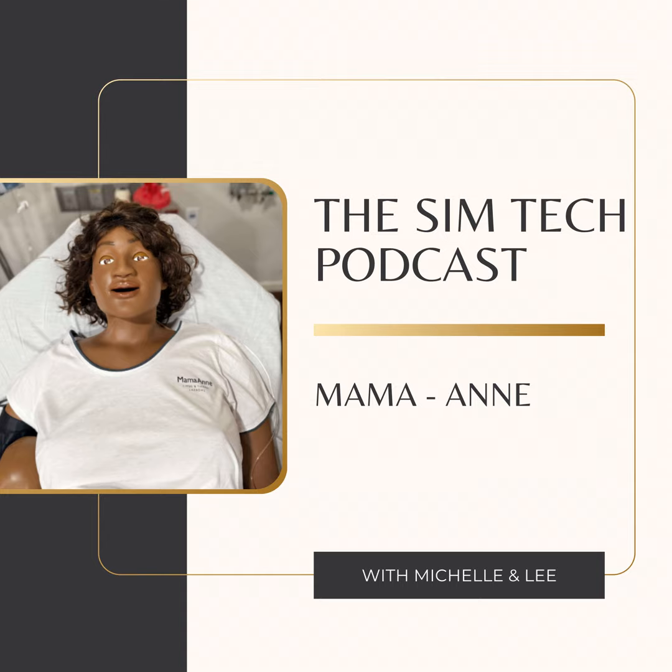You do get your QCPR feedback on here, so it gives you depth feedback on your CPR compressions. It pops up with a timer in the middle telling you how long you've been off the chest for doing compressions, and then this section here, if she was connected with a bag valve mask, will show if you're doing effective ventilations or not. The CPR history lets you see the consistency of your compressions and ventilations over that time period, so you can use that for part of your debriefs.